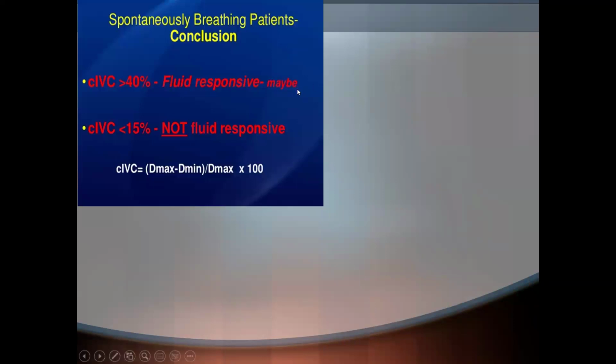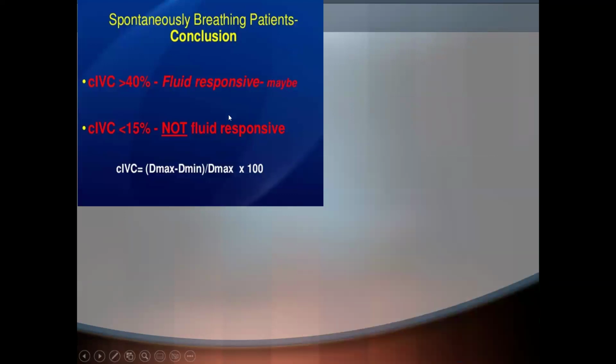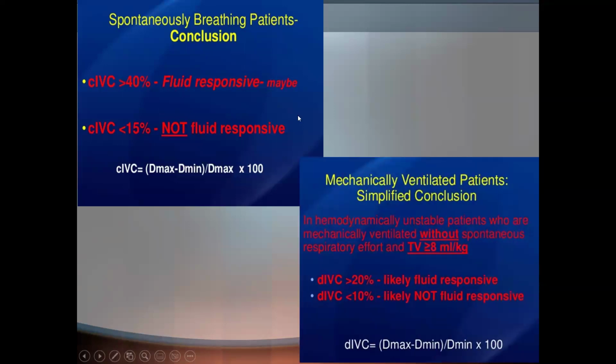Now we will interpret our data. In spontaneous breathing, as we said, if the collapsibility index is more than 40%, the patient may be fluid responsive. If the collapsibility index is below 15%, the patient is surely not fluid responsive. This is for spontaneous breathing.